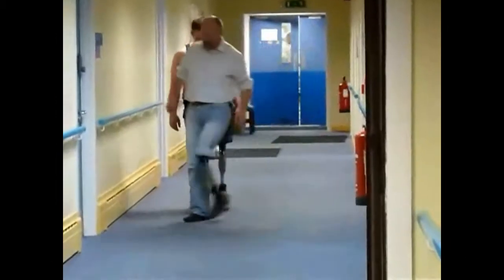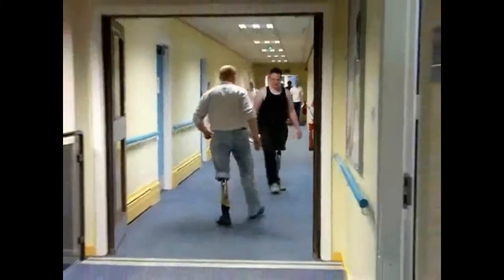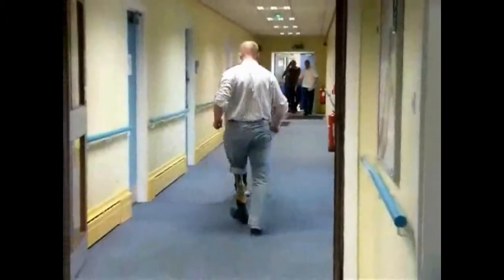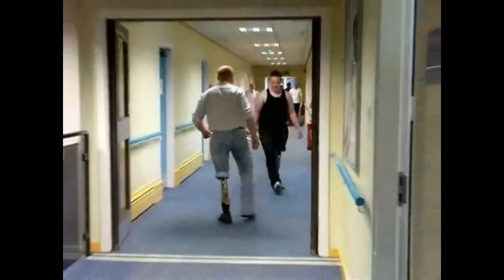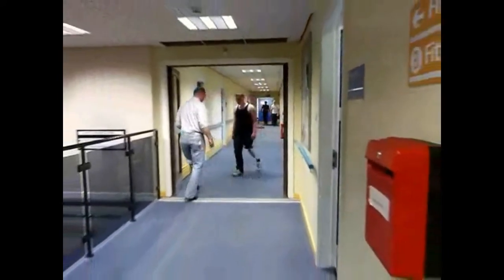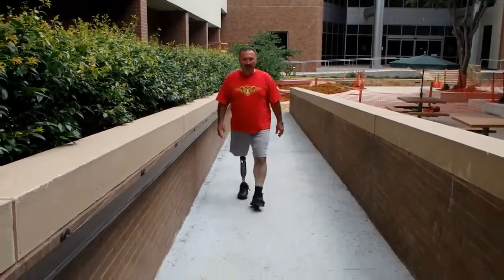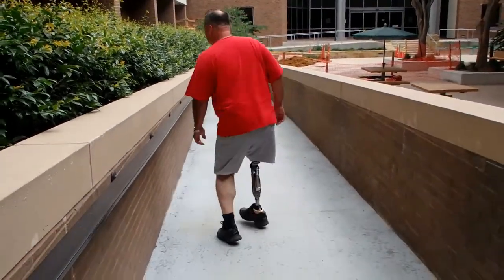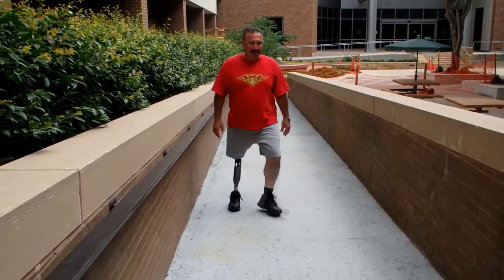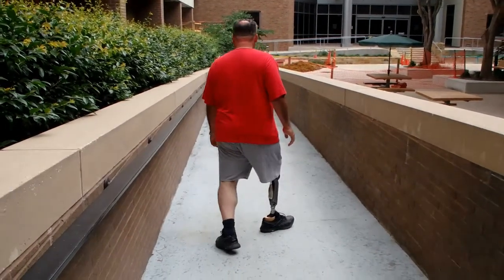One thing amputees do is they learn how to walk backwards in a knee so that they're ensured that they will not go down, because walking backwards is scary for amputees. This gentleman doing the educating and demonstrating is very skilled at walking backwards, but notice that he walks pretty peg leg going backwards, a normal AK gait. This gentleman has worn the VGK for maybe 10 minutes, and I showed him walking backwards, and I said, now, I want you to go down this ramp, and I want you to spin and see if you still have stability.